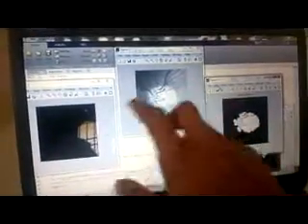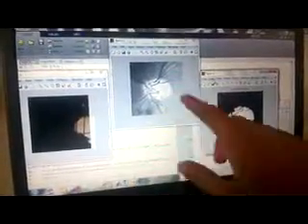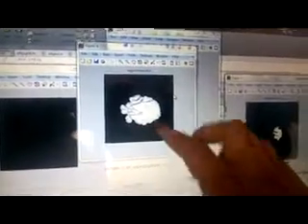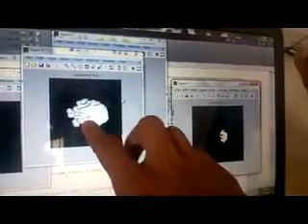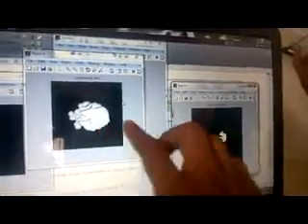If the pixel value is less than 230, it will show the dark side, which means black. If it is greater than 230, it will show the brightest part, which means white. Then from the segmented disc, we have to separate the cup. For that we used the same value, 230. The optic cup will never have nerve fibers, so it is easy to find the cup region.